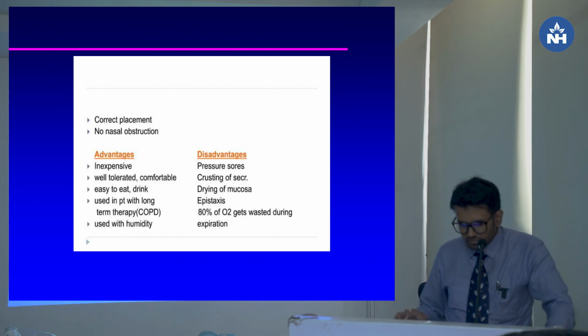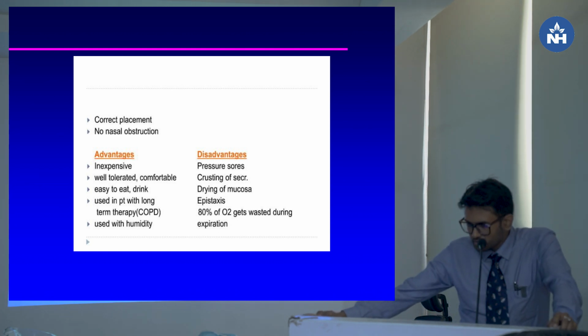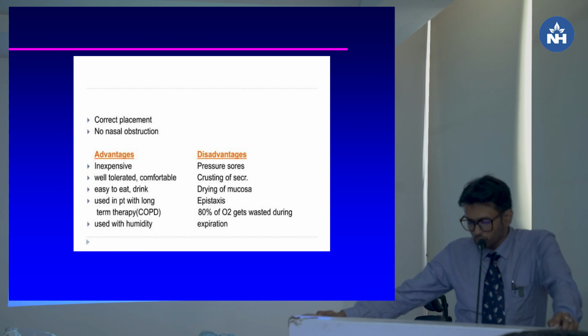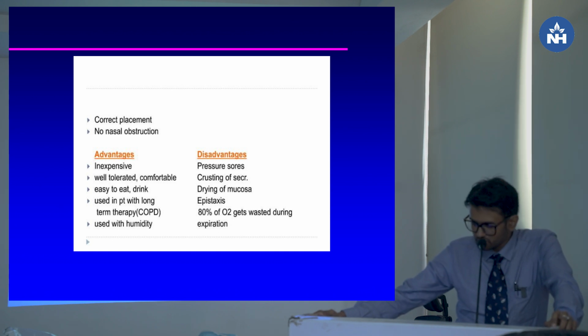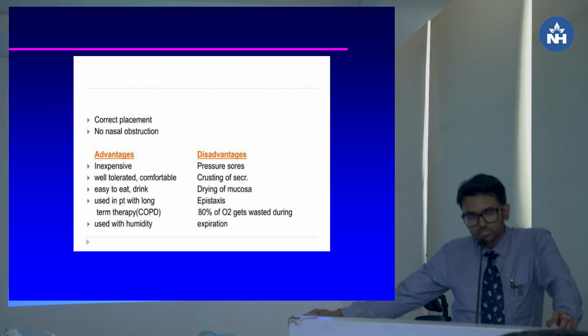It is inexpensive and well tolerated, and the patient can eat and drink. It is sometimes used for COPD patients. The problems are that it can cause pressure sores, crusting, dryness of the mucosa, epistaxis, and too much oxygen is wasted.